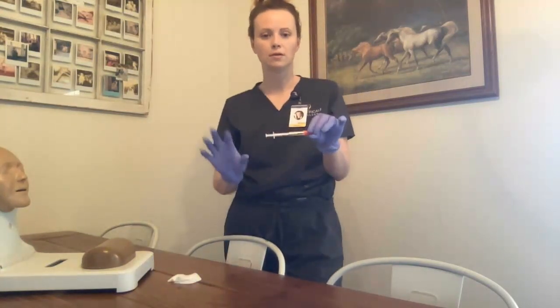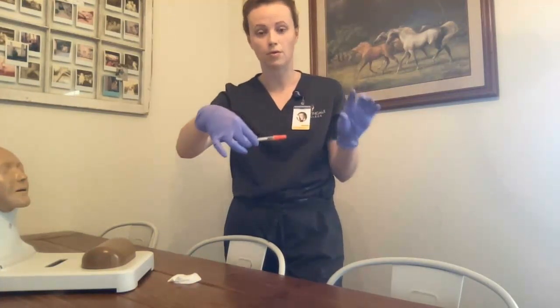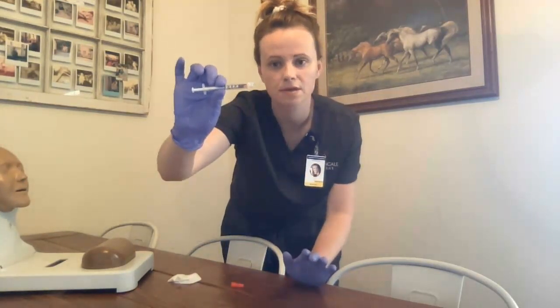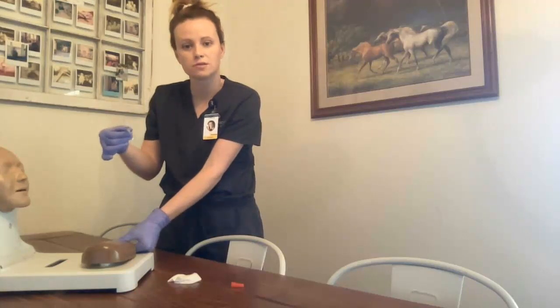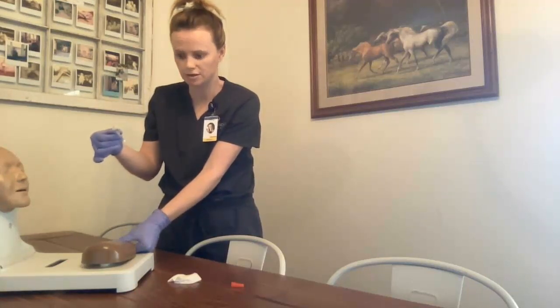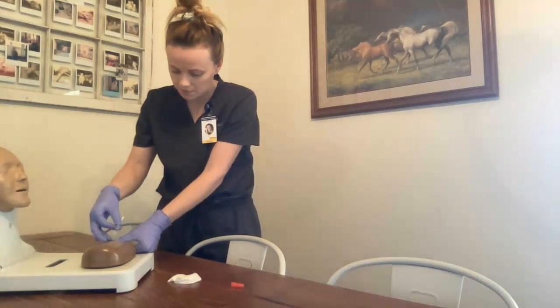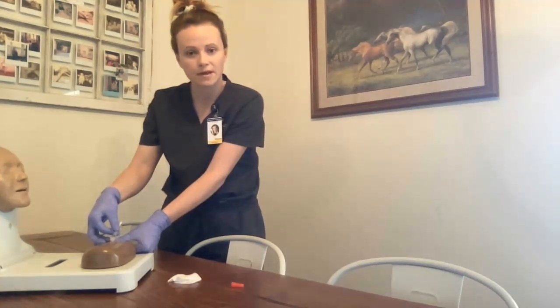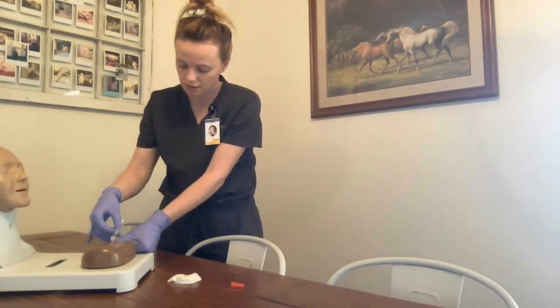When injecting the needle, I want to use these two fingers and hold the needle as so. I will remove the cap like that. I need to ensure that the bevel part of the needle is pointing upward upon injection. I will then get my thumb to pull or stretch the skin slightly, and inject the needle at a 5 to 15 degree angle. I need to feel resistance — and I do. I will then advance the needle through the epidermis about one-eighth of an inch and then slowly inject.